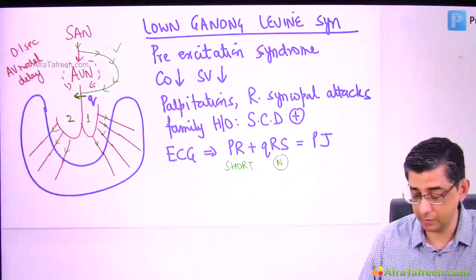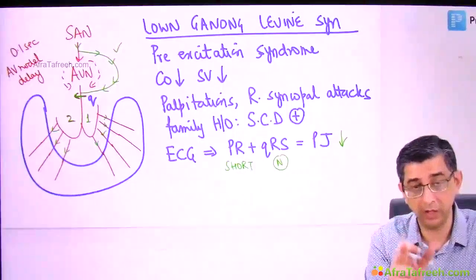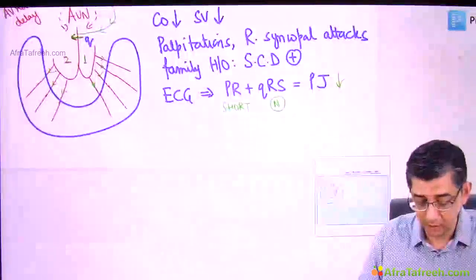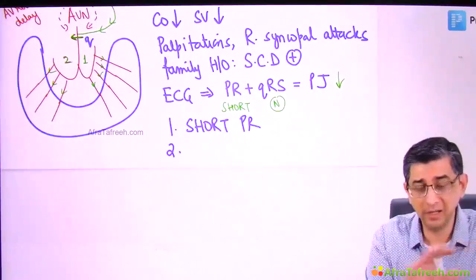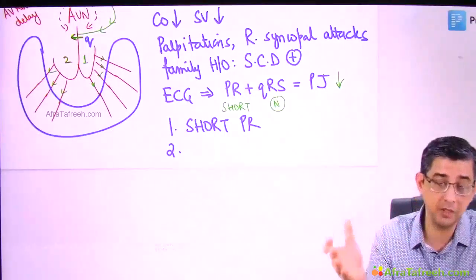So what is going to happen to PJ, guys? PJ will be short. If you're listening carefully, you would notice that in WPW, PJ was normal, but now I'm teaching you PJ is relatively lesser. Just for the sake of completion, I want you to remember that when it comes to a short PR interval, you can declare a guy medically unfit, or at least subject him to specialist evaluation.